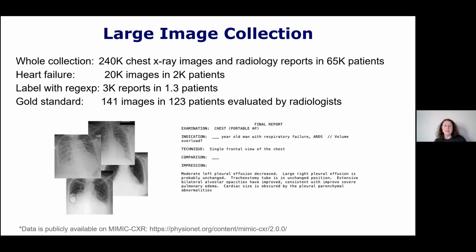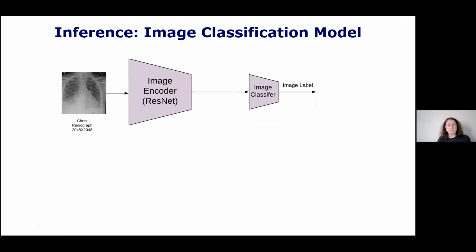So the idea here is that we label the images using regular expression keyword matching, and then we evaluate it by comparing it to the radiologist consensus. And so you can train a classifier and evaluate its accuracy, and it turns out it's not good enough. And so what I will show you today is our work on how to bring this to the level of accuracy that would become acceptable in terms of clinical practice. And in particular, in the next 3 slides, I'll show you the architectural innovations that we're doing.